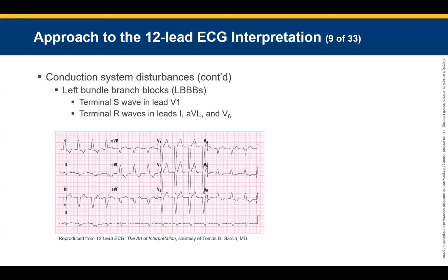Now, somebody's going to freak out when they hear me say that. There's a criteria we're going to go over next week on how to really narrow down these things and get honed in better on what is a bundle branch, what is a heart attack. I don't have you guys memorize that. We use it as a reference.